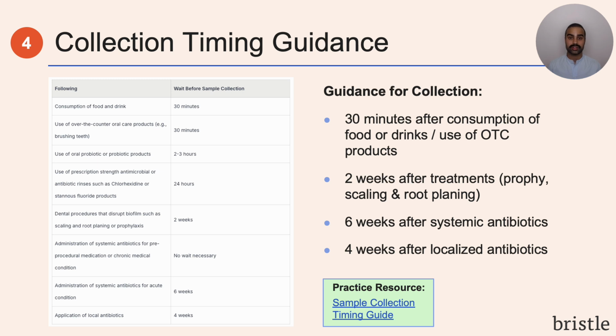For sample collection, make sure patients haven't eaten, drank anything, or used any oral care products at least 30 minutes prior to collecting the sample. This usually isn't an issue by the time the patient's sitting in the chair.